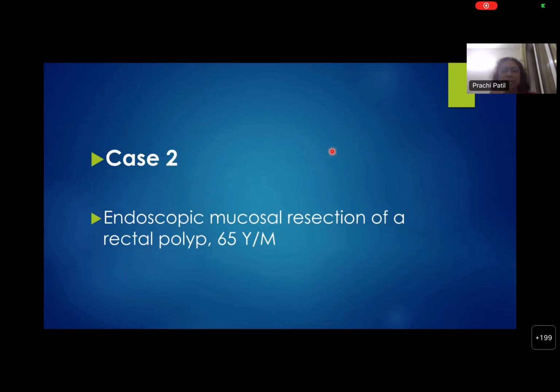Yeah, absolutely. That's a very important issue. And yes, endoscopic findings are invaluable. In fact, we should not begin to diagnose the polyp without endoscopic findings. Also, I think now we would prefer not to send you biopsies really, because biopsies might be non-representative, like you showed the polyp just now. I mean, not all parts are equally bad. So there could be a sampling error.